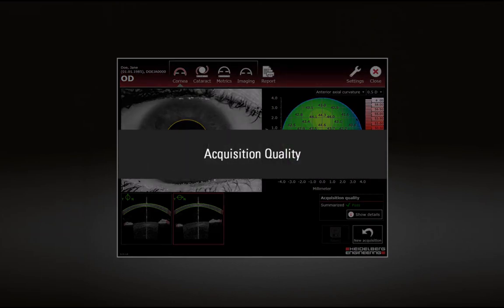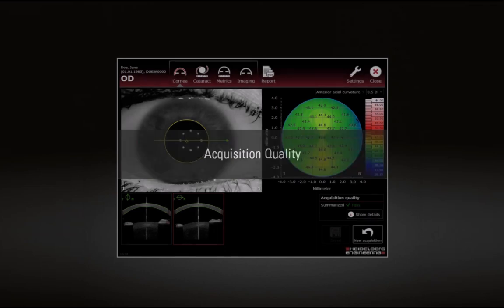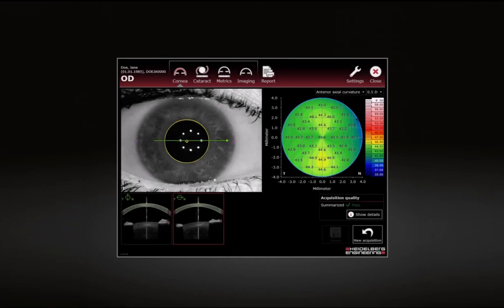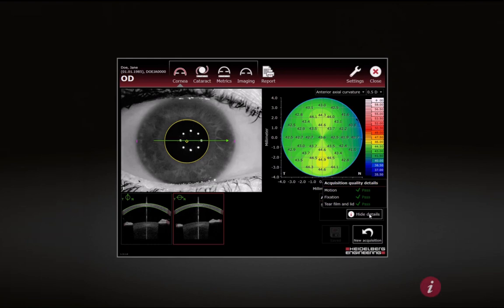Acquisition Quality. After the examination process is completed, the Acquisition Quality is checked. To display the detailed Acquisition Quality results, click Show Details. For more information, click the Info button below.